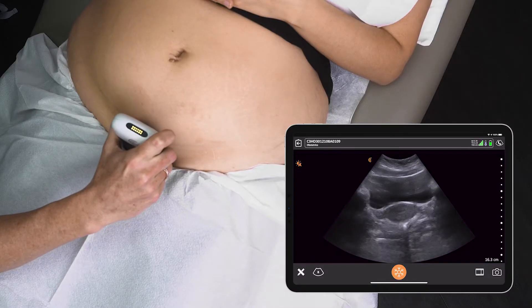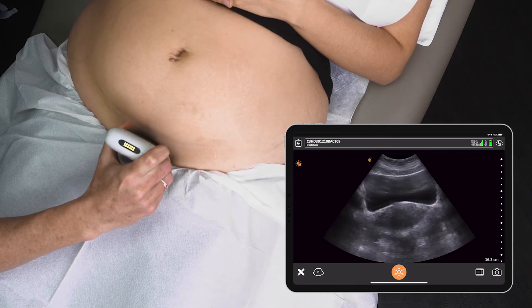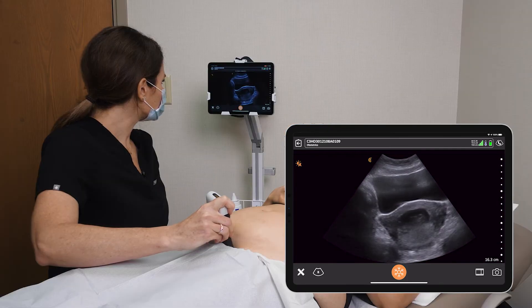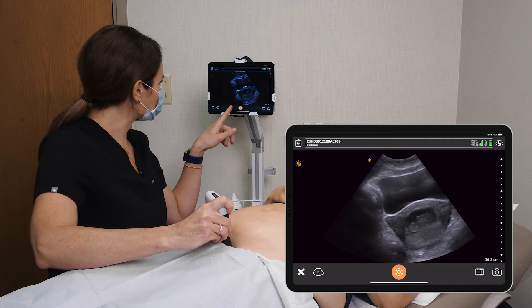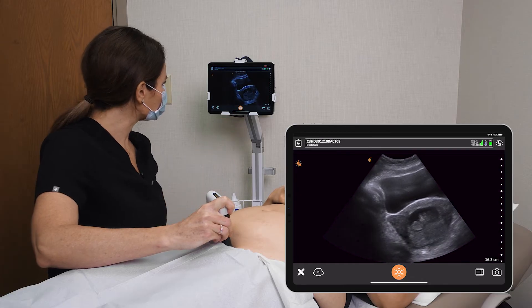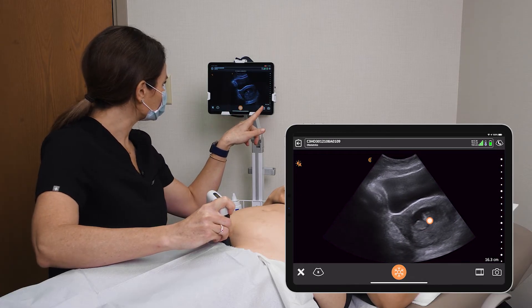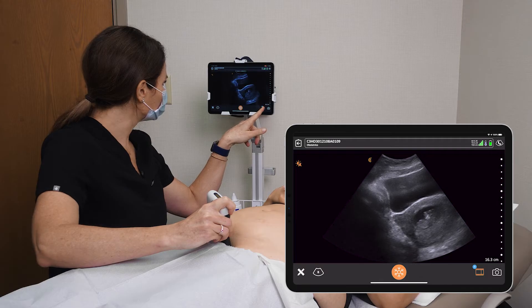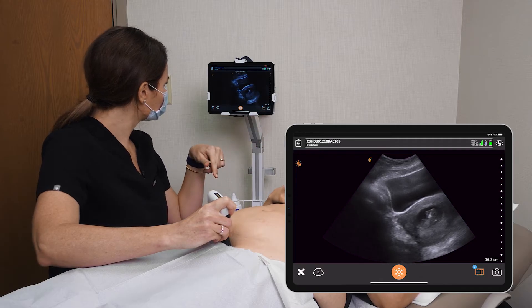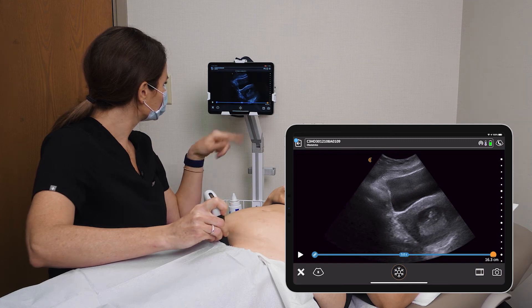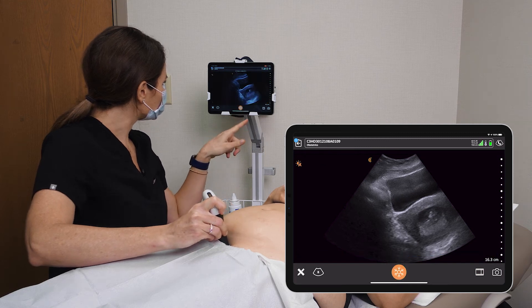I'm going to start scanning transversely here. You can see your full bladder. I can see a nice gestational sac, I can see your baby there — looks great, fetal heart beating. I'll take a little video of that for you — perfect.